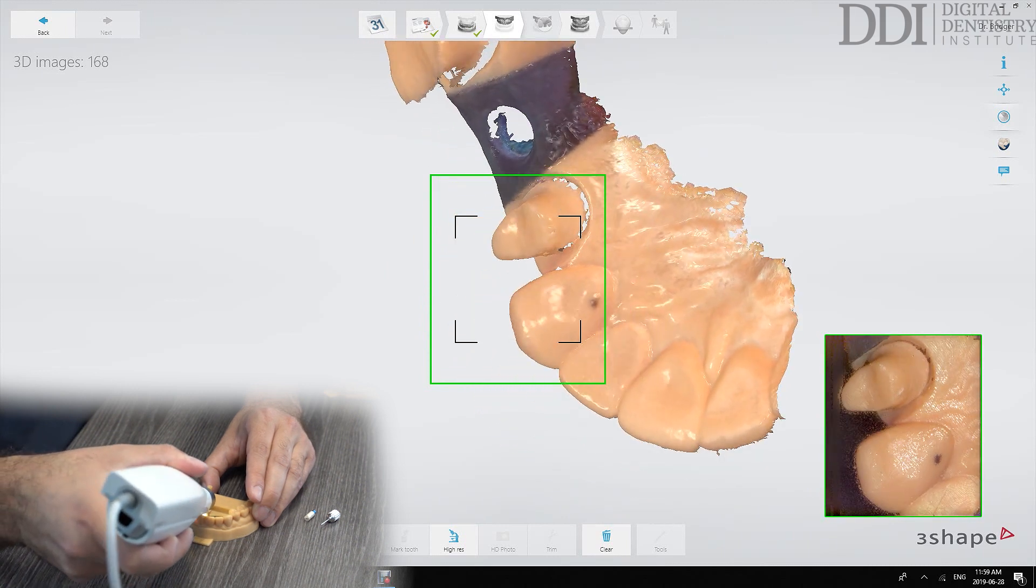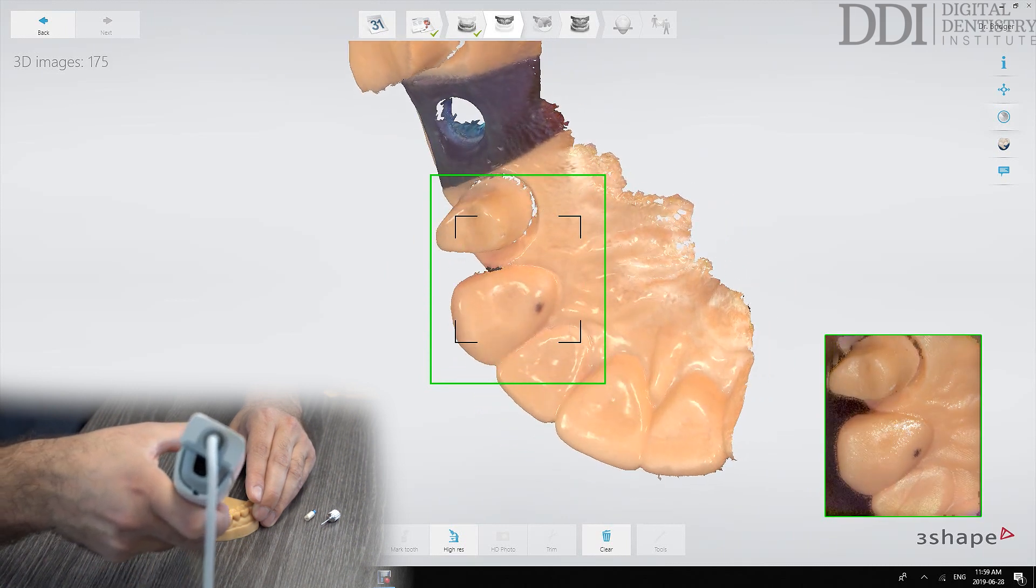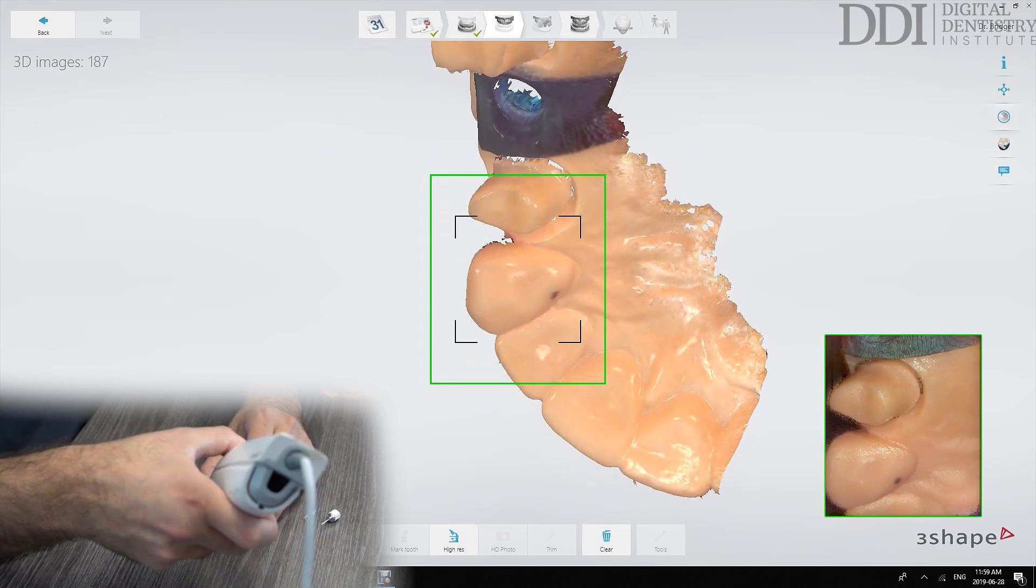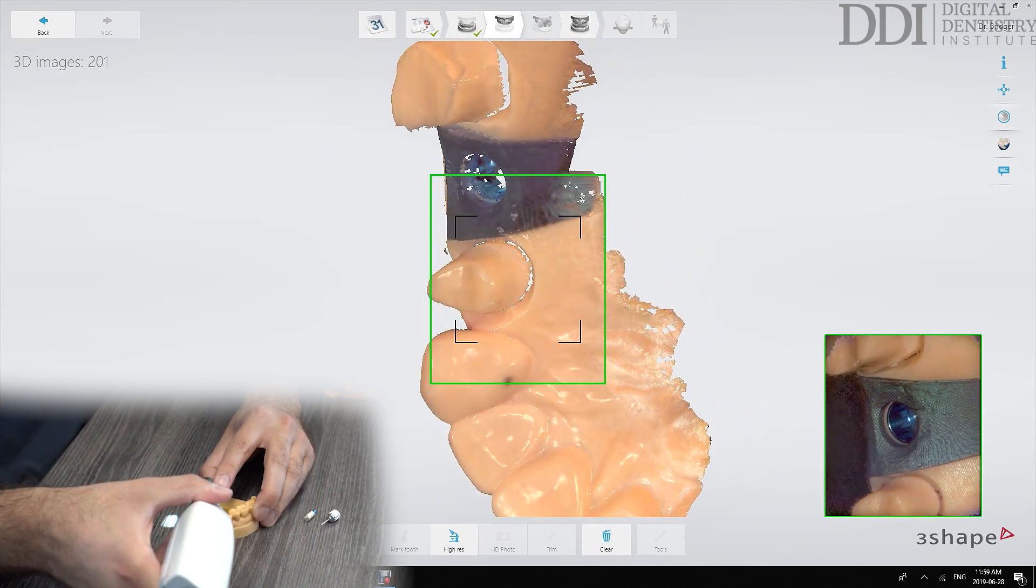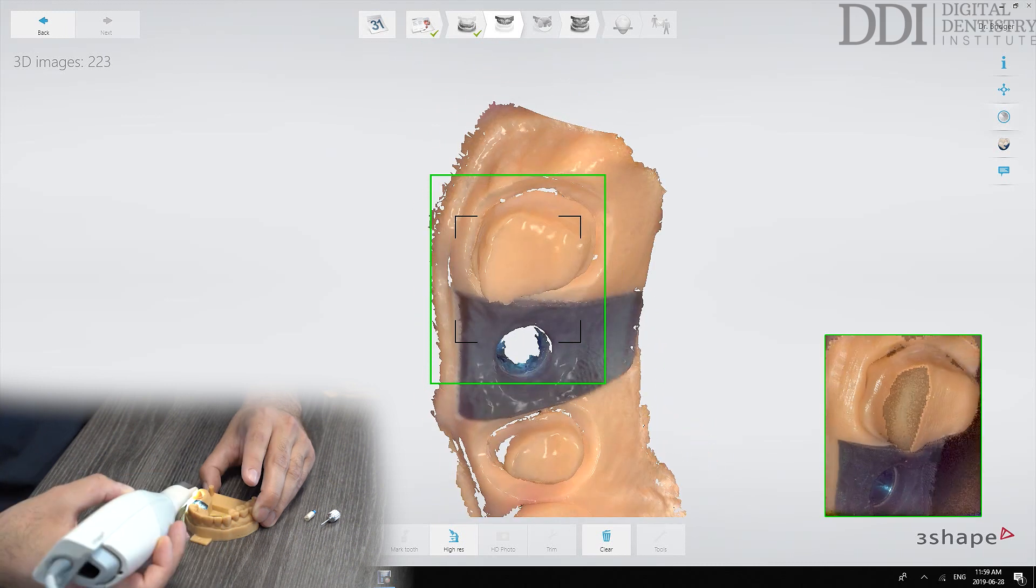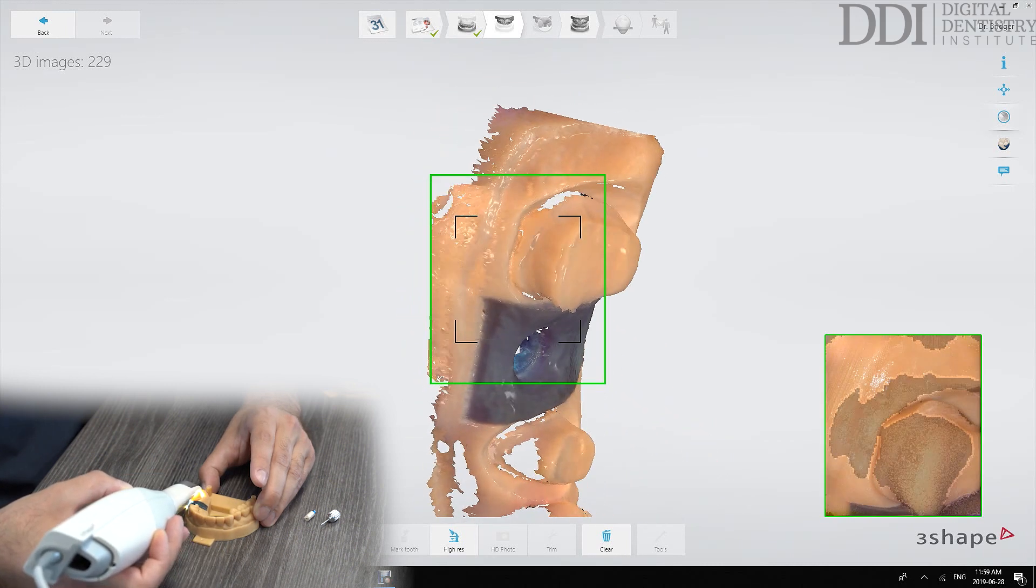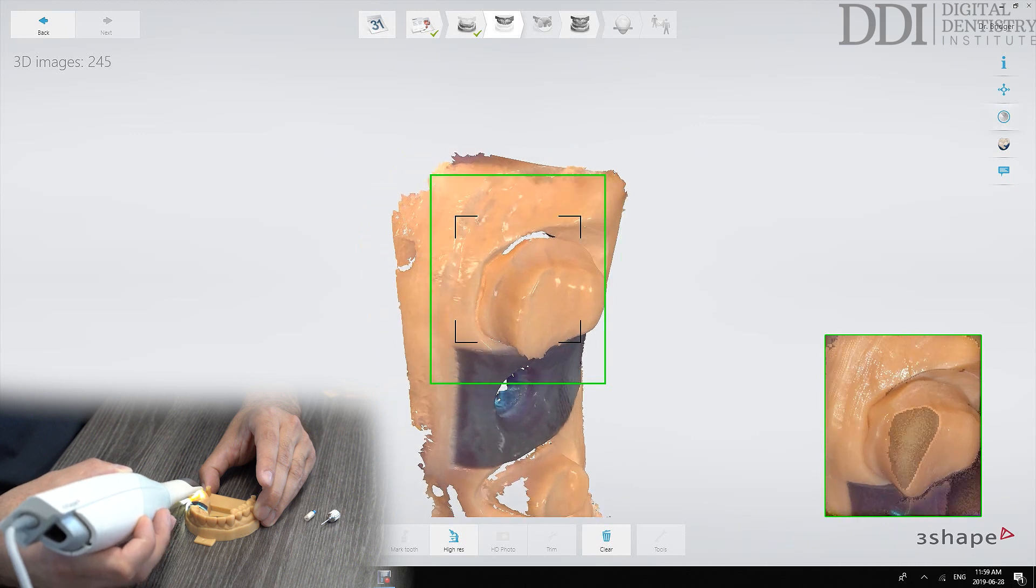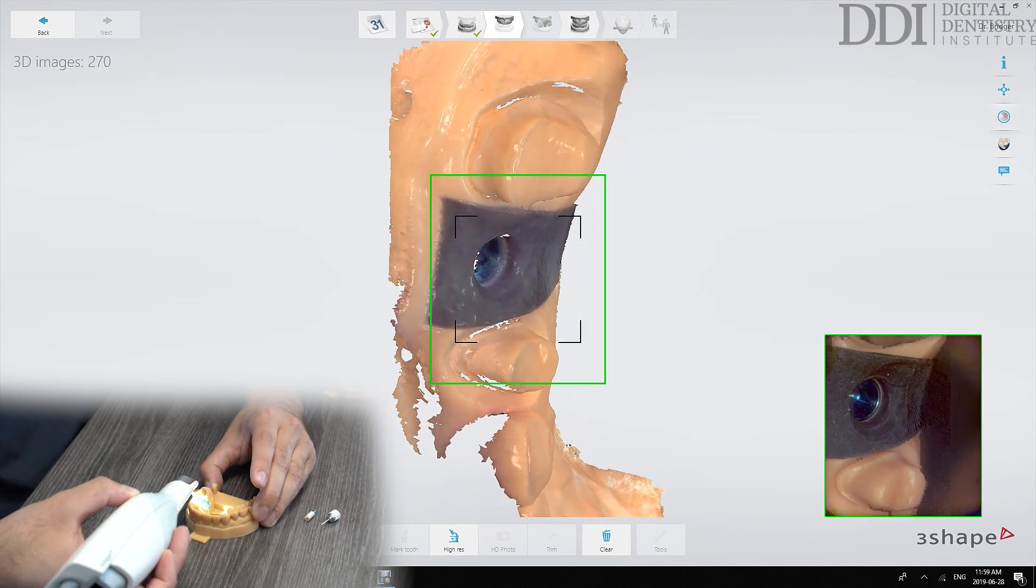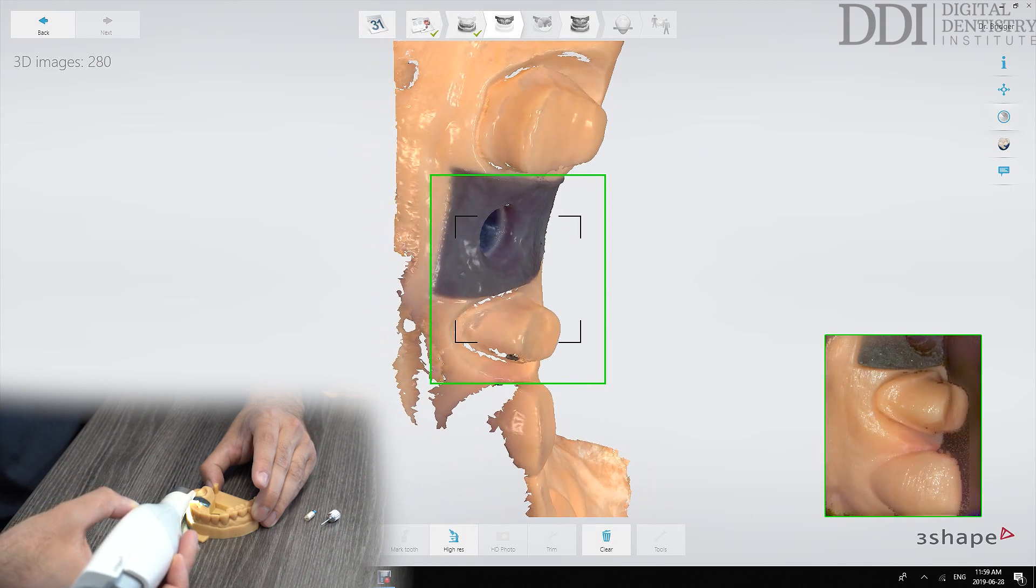Making sure we're capturing the distal on that canine because that's going to identify our proximal contact and making sure that we capture all the margins on those crowns. We're then moving to the buccal aspect again ensuring we capture all of those margins. Capturing the emergence profile there where the implant is.